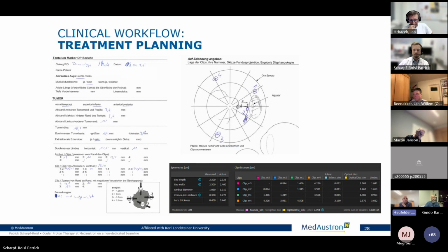Next question is from Juliane Darts. To create the fundus projection, do you use the exact geometry of the camera that was used to acquire the fundus image? I have to give a strong no there. We just use the polar projection. We don't use the camera mode currently.